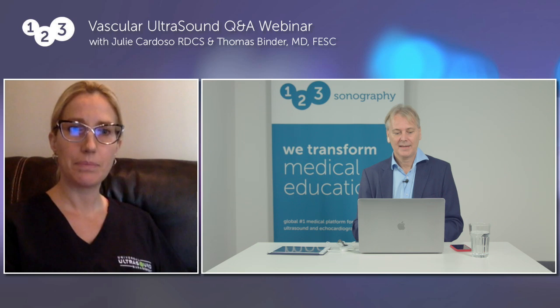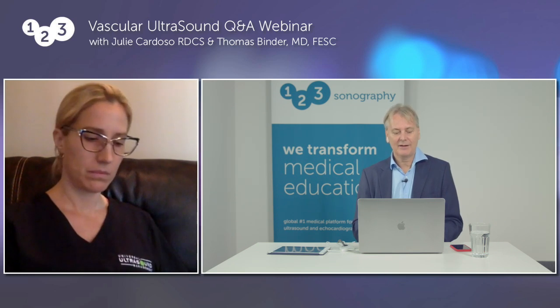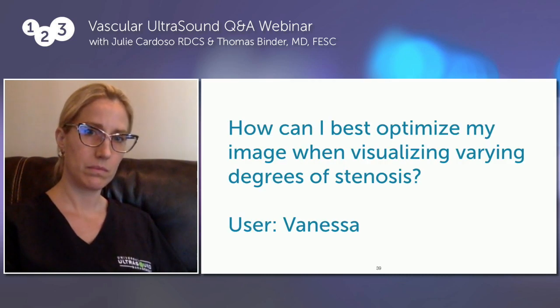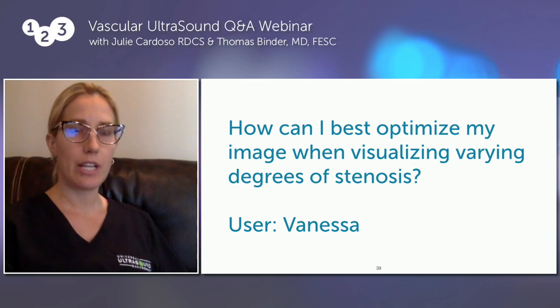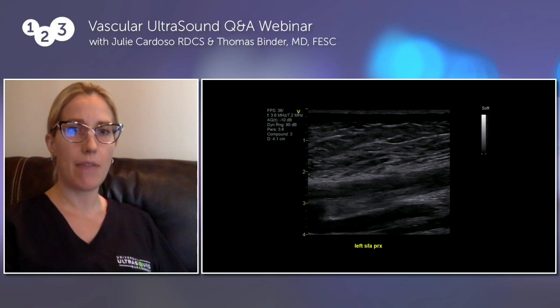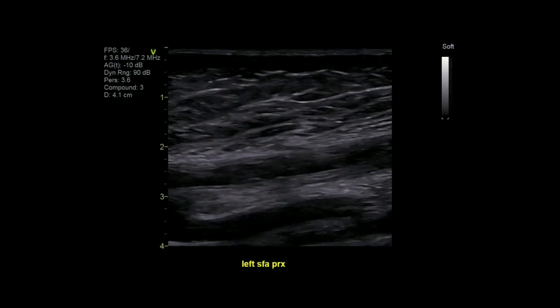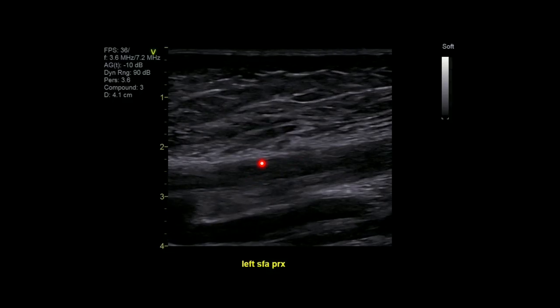Absolutely. Let's come to another question asked by Vanessa, and she wants to know, how can I best optimize my image when visualizing varying degrees of stenosis? Well, this is a great question and can be answered in multiple ways. First of all, you want to look at the plaque characteristics in B mode, as you can see in this image right here. You can see we have a different echogenicity within the lumen. So we're not really sure what the degree of stenosis is.